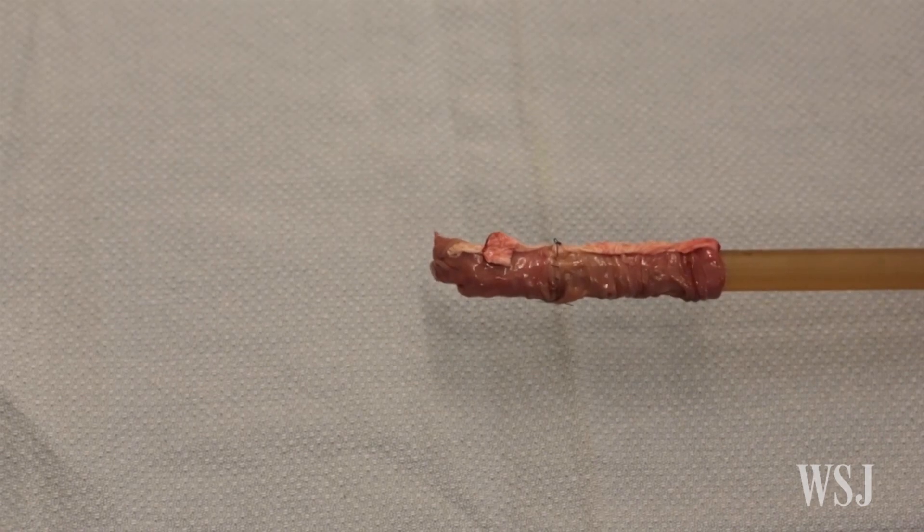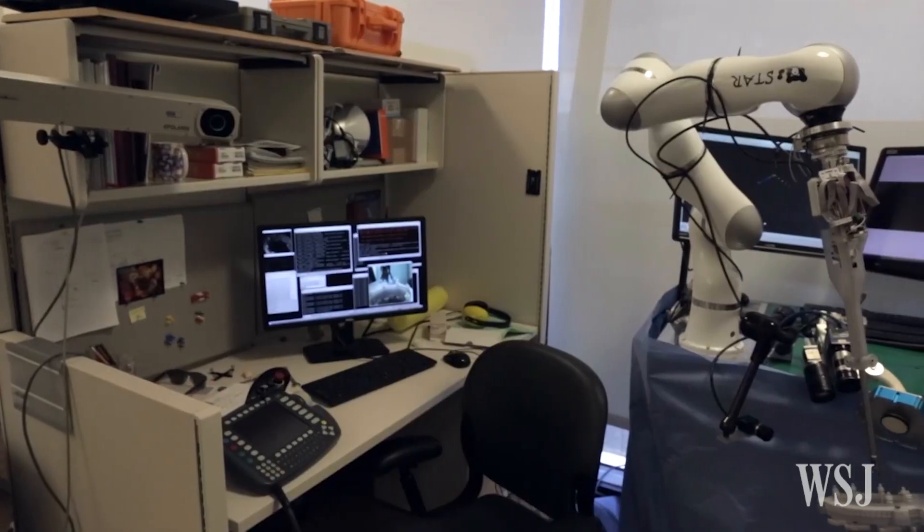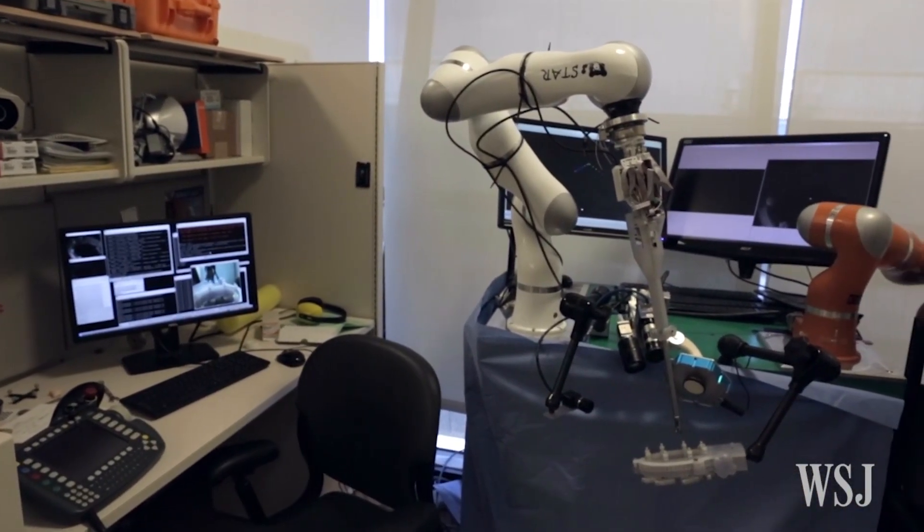This machine and Axel and our team have made it super smart by incorporating best surgeons' techniques into it, so that it determines how the surgical task can be accomplished without having surgeons' input.